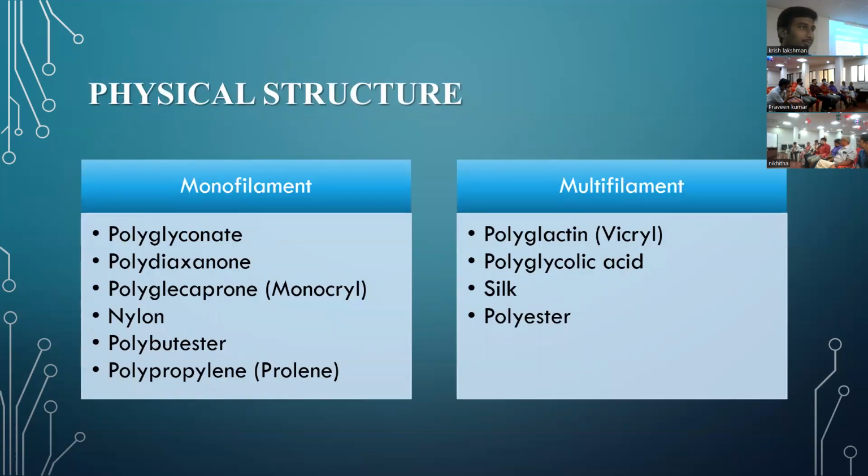Can you tell me what are the sizes of the suture we use? What do you normally use in routine practice? 10. What is that 10 derived from? Because I learned about it when I started preparing for the class. What does 10 denote, or what metrics is it? Is it centimeter, meter, kilometer? What exactly are the metrics? I'm not sure, but they again mentioned some length below that.